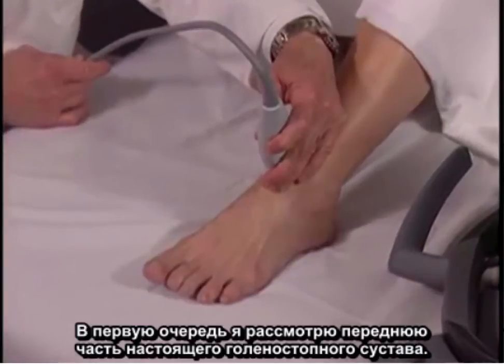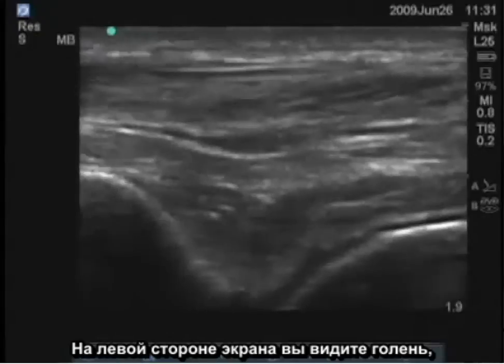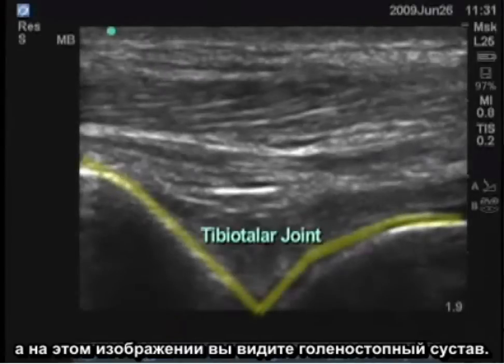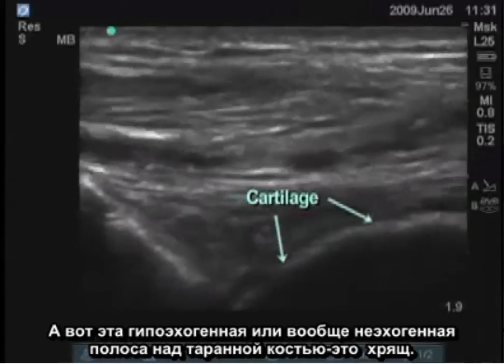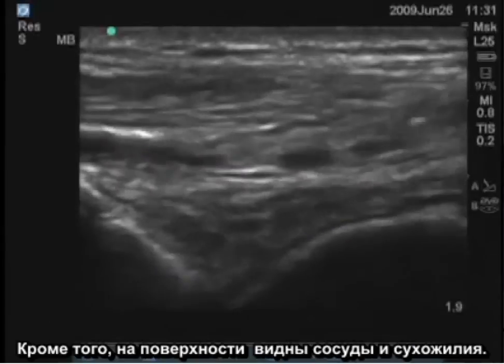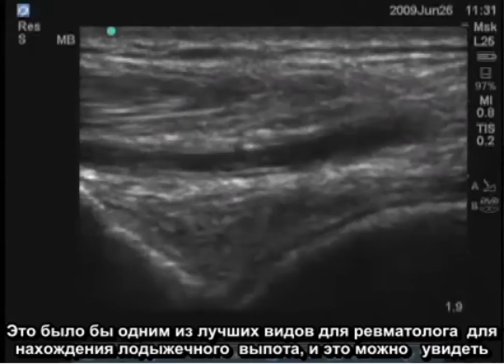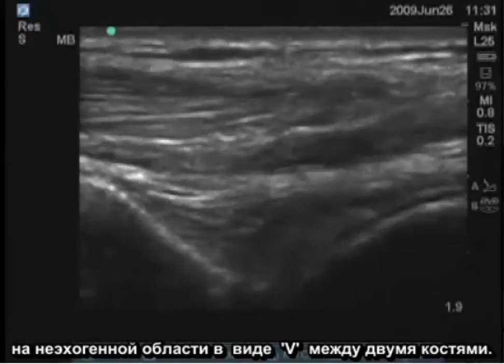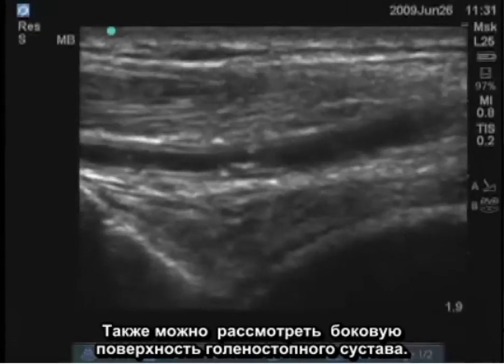I'll examine the anterior portion of the true ankle joint first. On the left side of the screen is the tibia, and in this view you see the tibiotalar joint. There's a hypoechoic or anechoic stripe over the talus, which is cartilage. There are vessels and tendons superficially. This would be one of the best views for a rheumatologist to find an ankle effusion, which can be seen as an anechoic area in the V between the two bones.